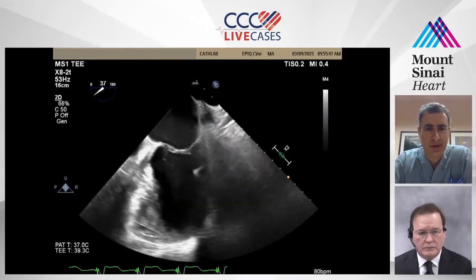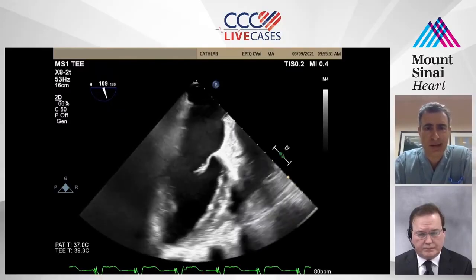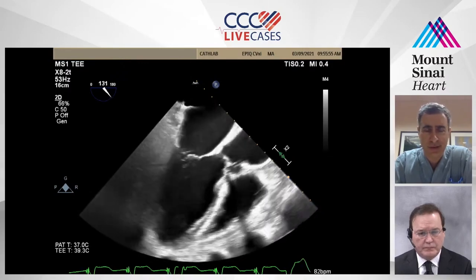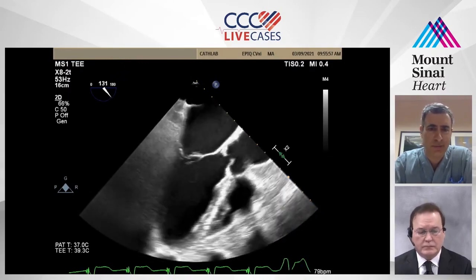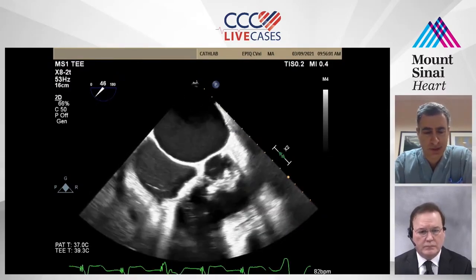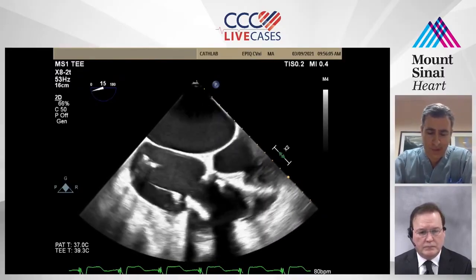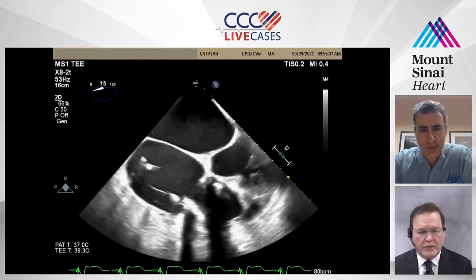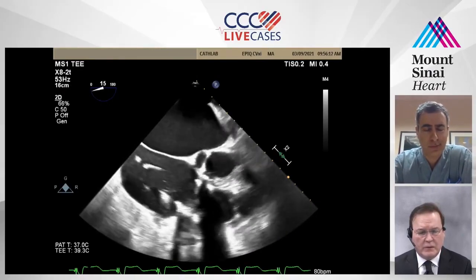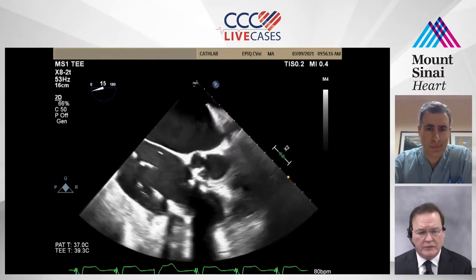This patient is going to have a gradient in the morning of 4 or something like that. And tricuspid stenosis in a bioprosthetic valve is not the same as in a native valve. So I think he has a gradient of 4 or 5. He will feel dramatically better compared to what he just did. Diffusion. I mean, that RA pressure was at least 20 when we started. RVEDP was about 12. Yeah, good.